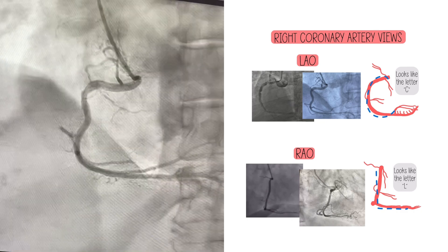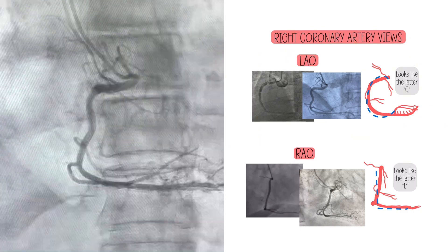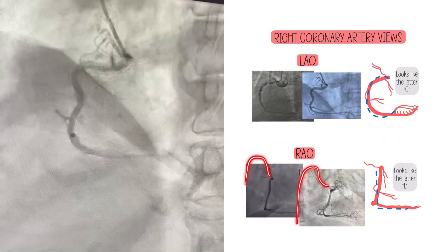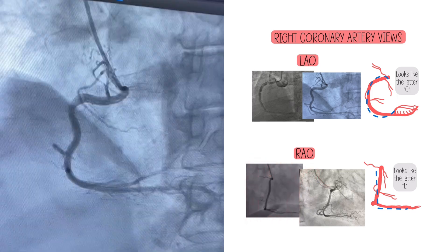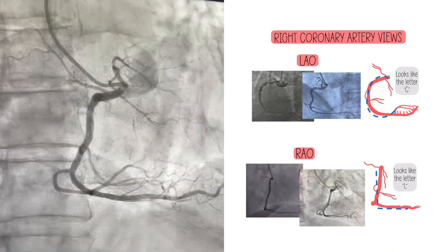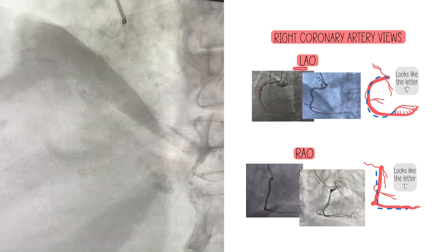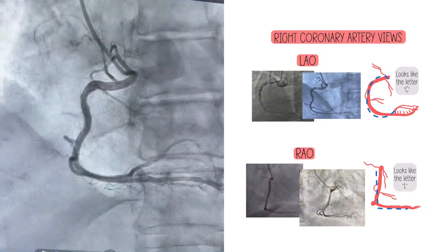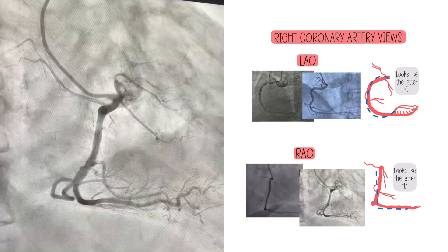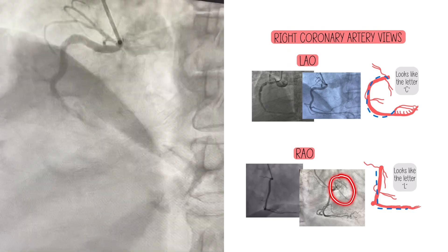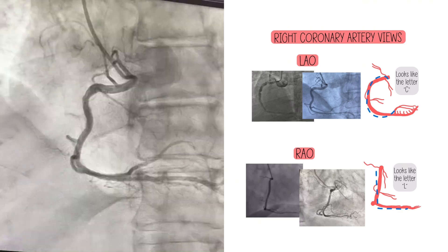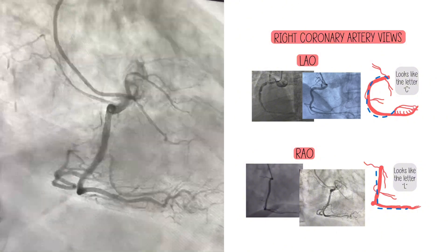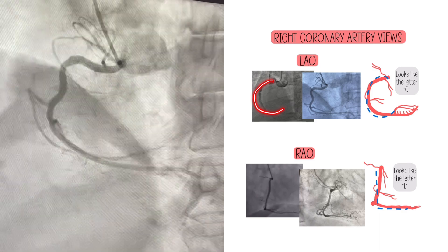You can tell the view by the spine rule: if the spine is on your right, it's LAO; if the spine is on your left, it's RAO. But when you can't appreciate where the spine is, a curved C shape tells you it's LAO, and a straighter L shape tells you it's RAO. This will be more obvious in dominant or large right coronary arteries. In a non-dominant RCA, these might be the only two views you take — just an LAO and an RAO.